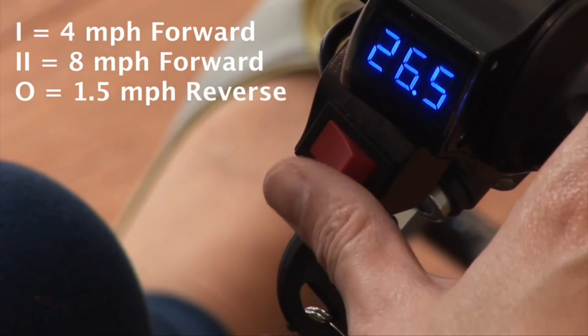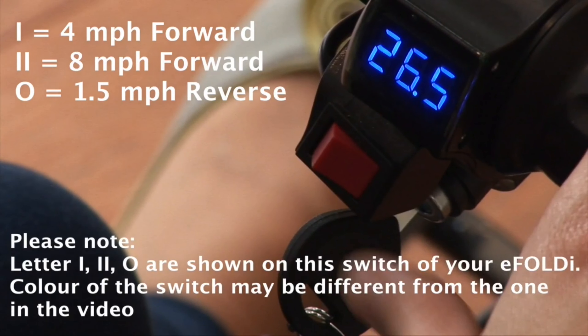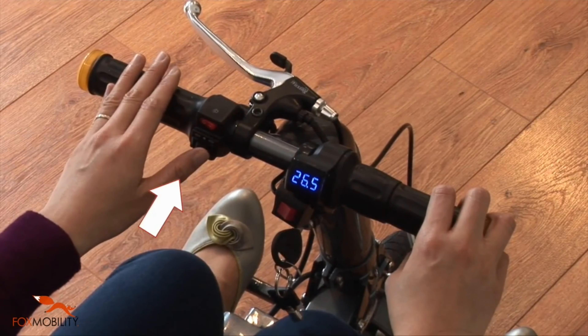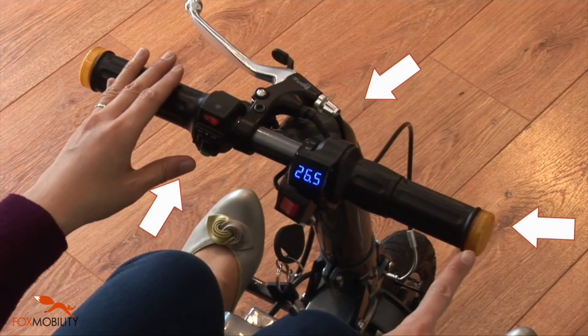One is for travelling at 4 mph. Two is for travelling on the road at 8 mph. The letter O is the sign for reverse. On the same handlebar, there are also switches to control front lights, the horn, and indicators.